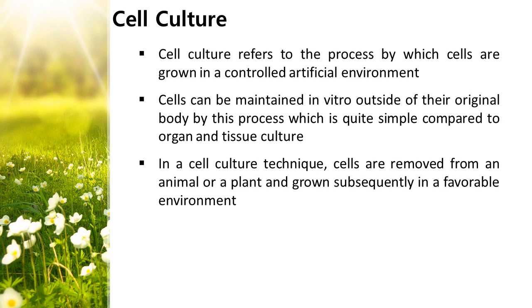Previously we learned about the cultivation of microbes, how to cultivate the microbes. Here we are going to cultivate the cells in a controlled environment, an artificial environment. That artificial environment is controlled by us. Controlling in the sense we can maintain the required things which promote the cell, and also we can control the growth of cells to the extent we need.